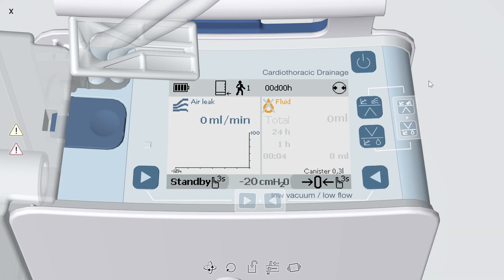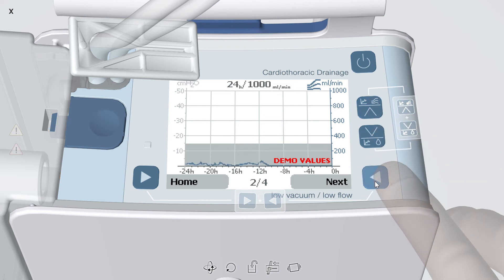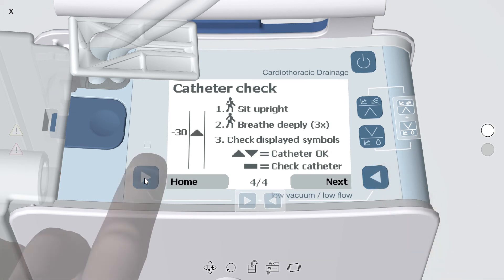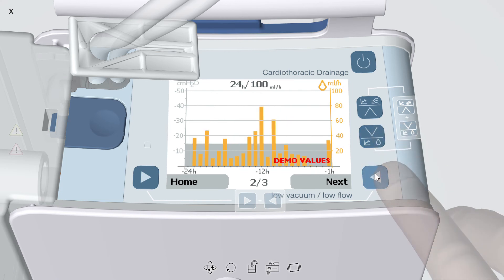Topaz Plus provides objective air leak and fluid data. When therapy is active, press the up arrow to access three air leak history graphs and a catheter patency check. Press the down arrow to access the fluid data screen and three fluid history graphs.